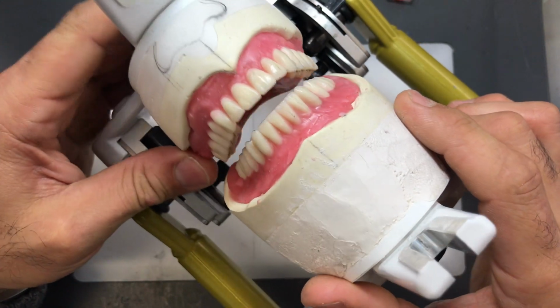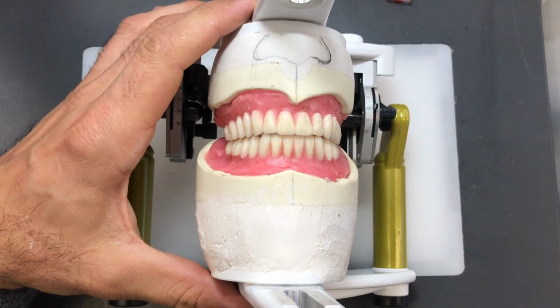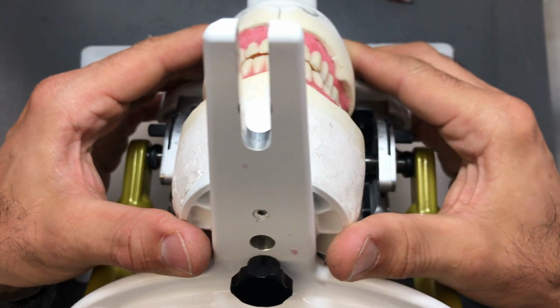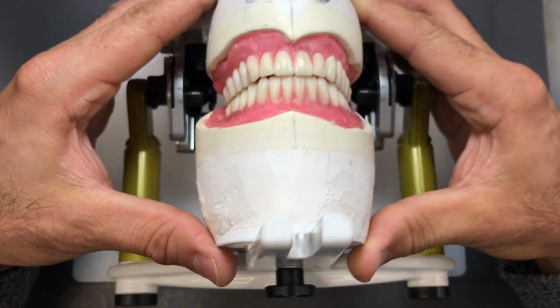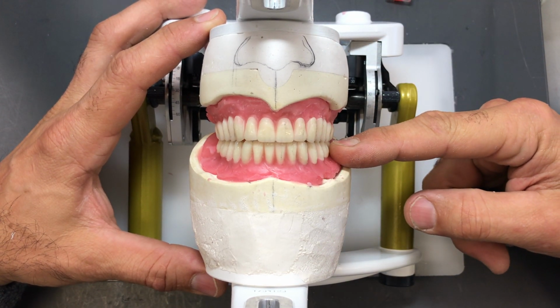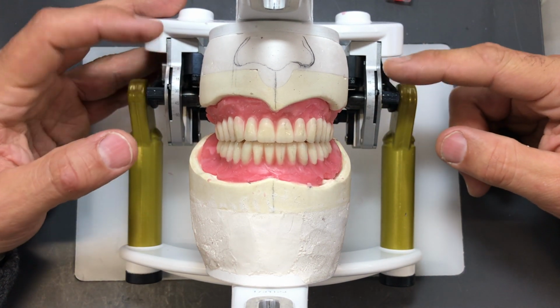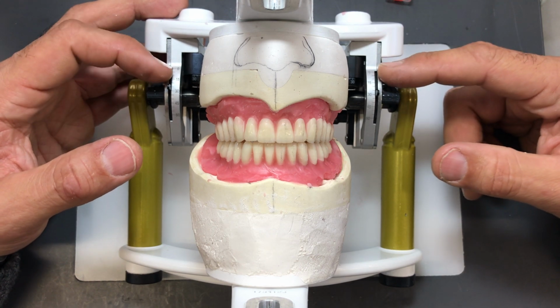you should have a distinctive loud sound between upper and lower occlusal surfaces, meaning you're getting a lot of contacts between upper and lower occlusal surfaces. And once again, this nice overjet and overbite was established as a result of the cuspal inclination, the compensating curve on either side, as well as the condylar inclination that we incorporated when we programmed our articulator.